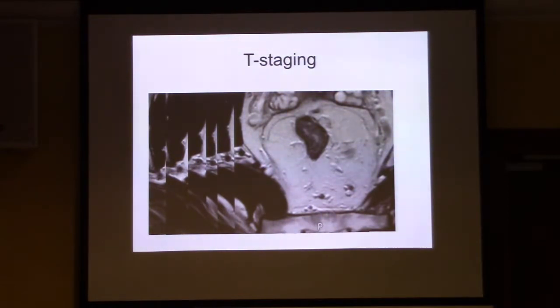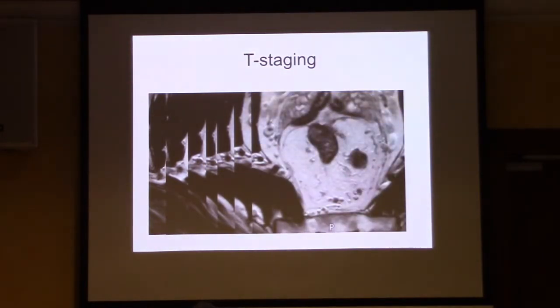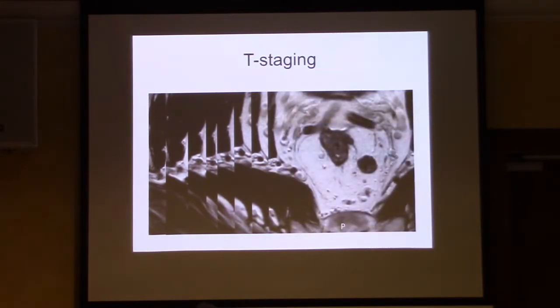And there, this is now the peritoneal surface. So you can see the peritoneal surface, high up in the rectum, is on the muscularis propria. So if you're unlucky enough to have a very small tumour here, which this patient has, all right, this has now grown onto the peritoneal surface. So although that actually has only gone through by maybe 1 or 2 millimetres through the muscularis propria, the next thing it hit was the peritoneum. So you might say, well, this is fine, this is a tiny tumour. No, it's not. This is T4A disease. This has gone onto the peritoneal surface.